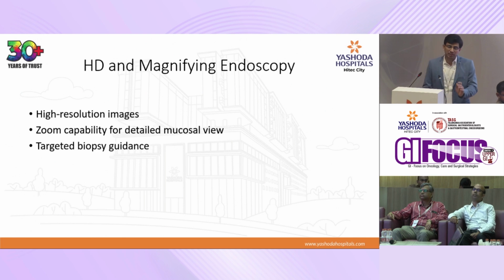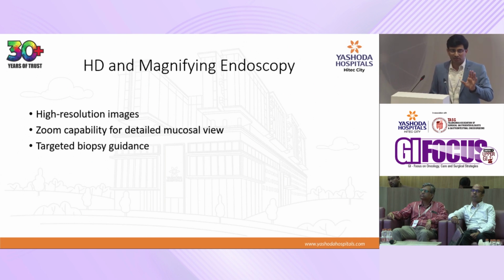Apart from blue light imaging, we have another technology, zooming in. Earlier this was not there. For the last 1 to 2 decades, we have zooming of the mucosa, where it is a real in vivo visualization of the mucosa.